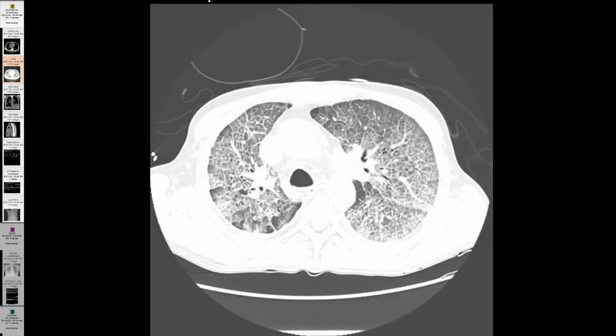But it's not exclusively found with alveolar proteinosis, and pneumocystis is one of the frequent imitators of that pattern. That's my case. Very nice example of that.